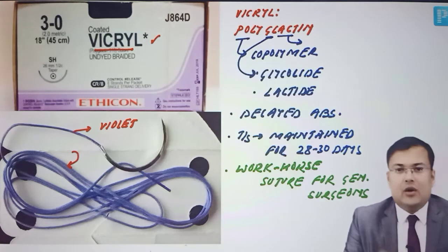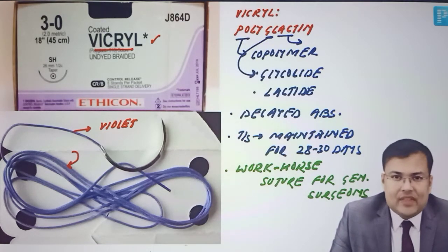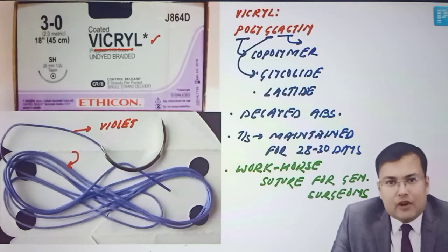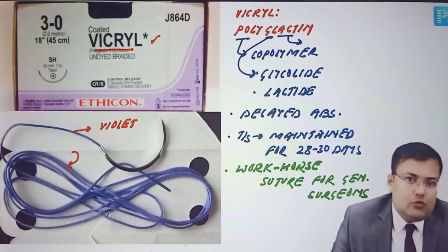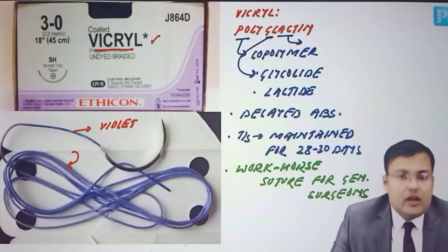Simple. Now, there is one important question. For the organs in which there is a tendency for stone formation, like the bile duct, ureter and bladder, if we are supposed to use suture for those organs, which type of suture should be used? Absorbable suture or non-absorbable suture?